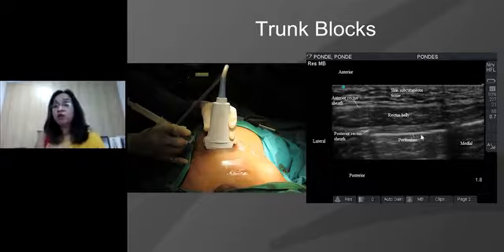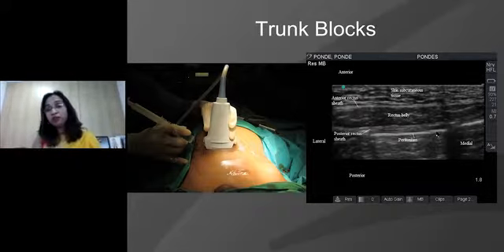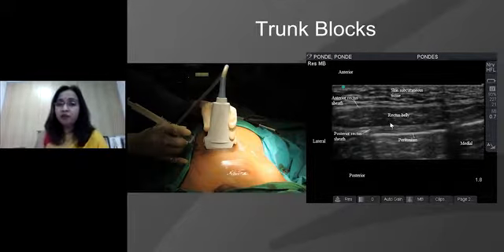This is the peritoneum. If you want to note here, the distance between the posterior rectus belly and the peritoneum is hardly what? In mm, because this itself is 1.8 centimeters. So if this entire thing is 1 centimeter, this is in millimeters, I guess. So the needle has to come in plane, under vision, and not beyond this point at all. And then we place our needle just proximal to, or before, the posterior rectus sheath, and then inject the drug.